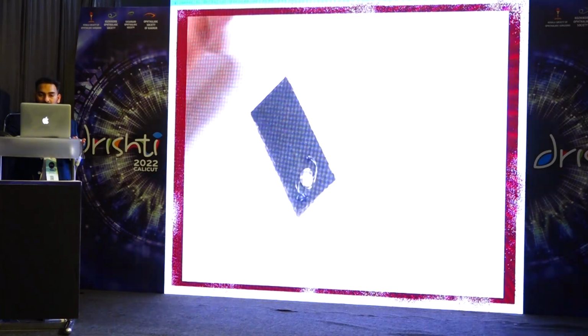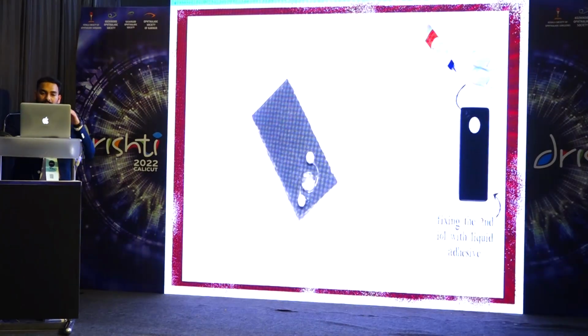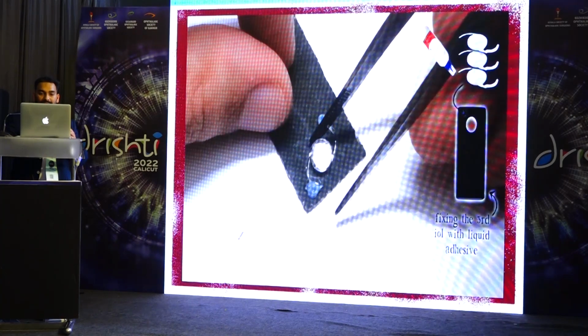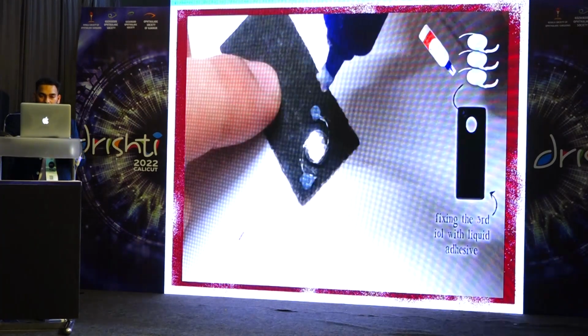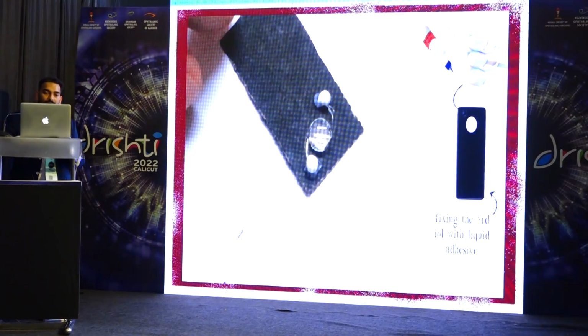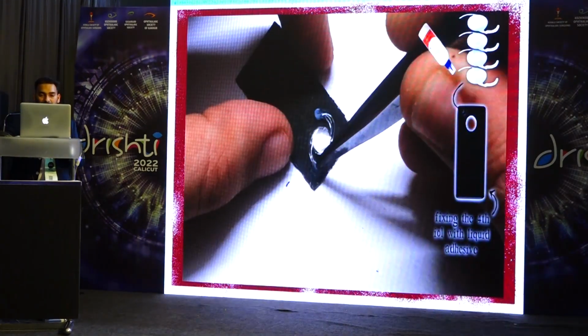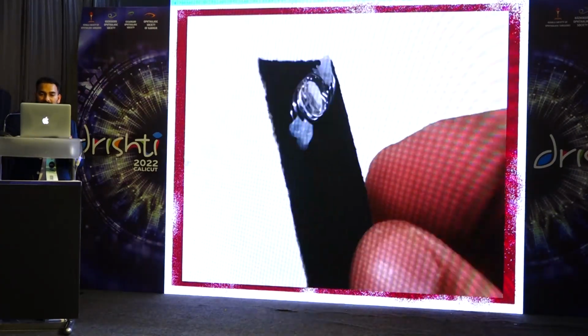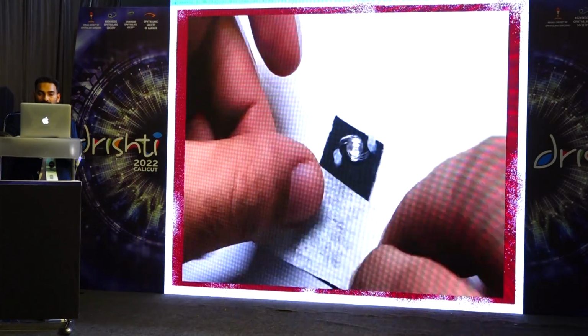You need four 30 diopter lenses to be kept one upon the other. You need to be sure that they are properly placed on each other. Once you do this, you're increasing the diopter of the lens, and once it's ready, you can put it on the phone.